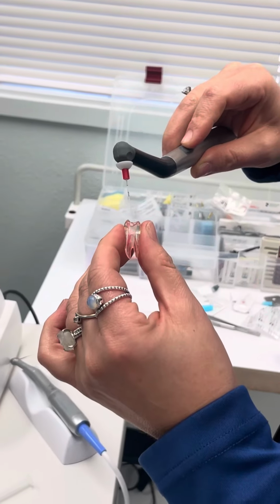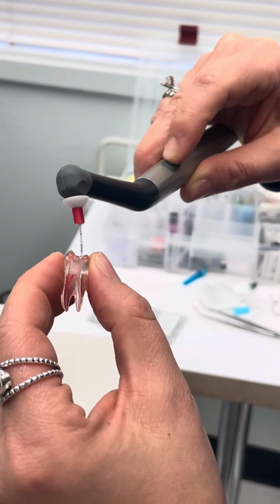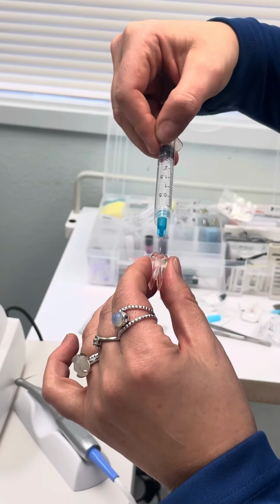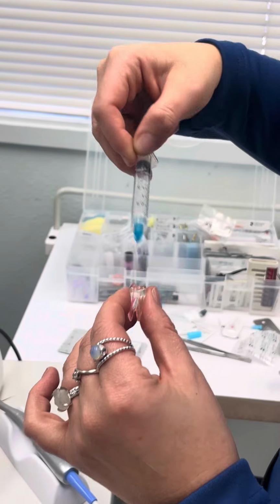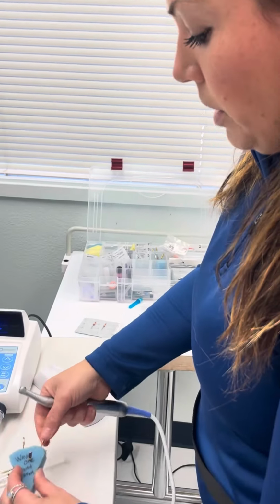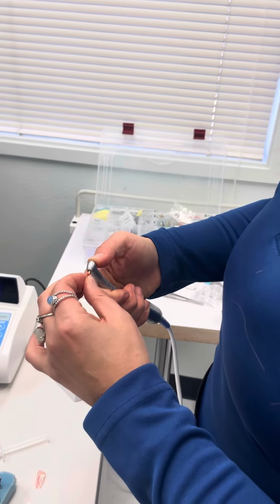Endo activate. Irrigate, irrigate, irrigate. You cannot irrigate too much. If you think you've irrigated too much, irrigate 3 times more. So then we're on our last file. Remember, we're going to work this one in thirds.